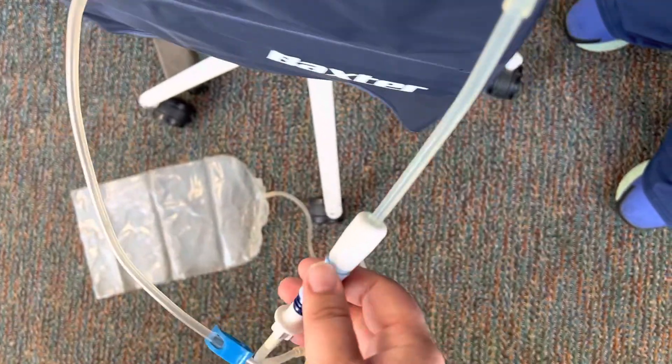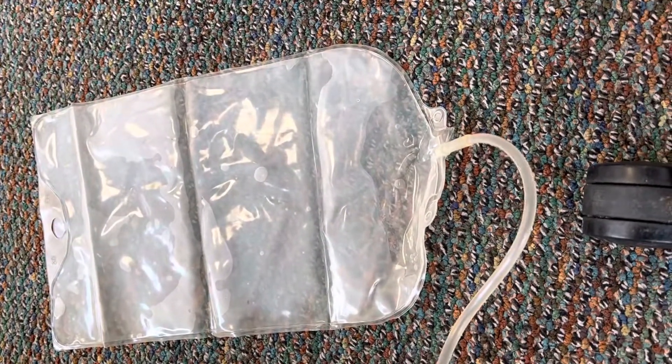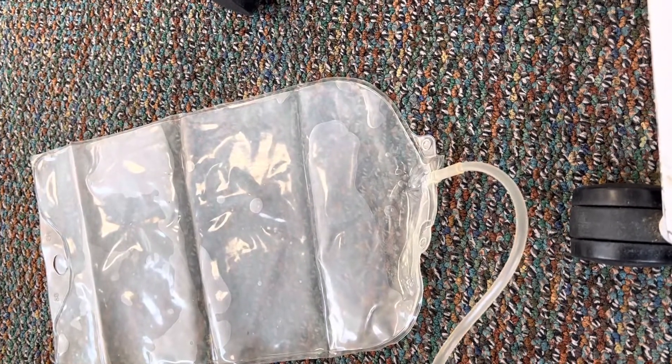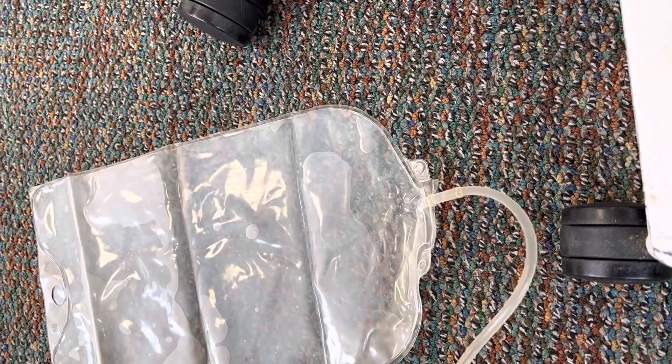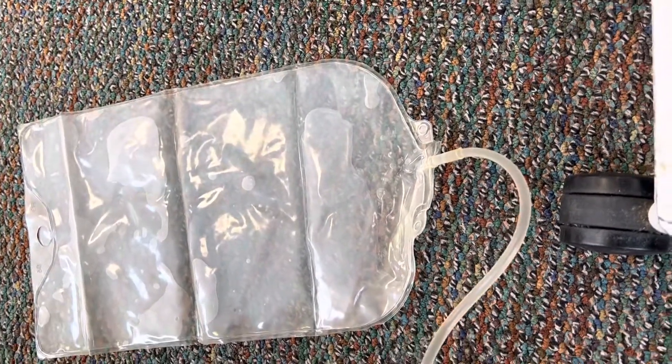The bag is starting to drain — it should be nice and clear, no cloudiness and no blood. One of the first signs of peritonitis is cloudiness, so if you see output that is cloudy that is a warning sign of peritonitis and you want to make sure you're notifying the provider.